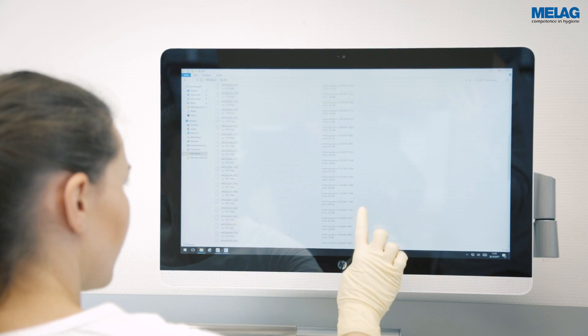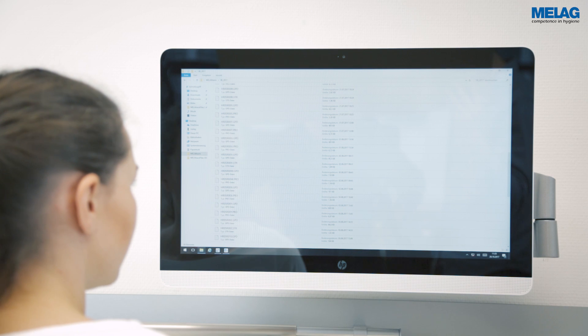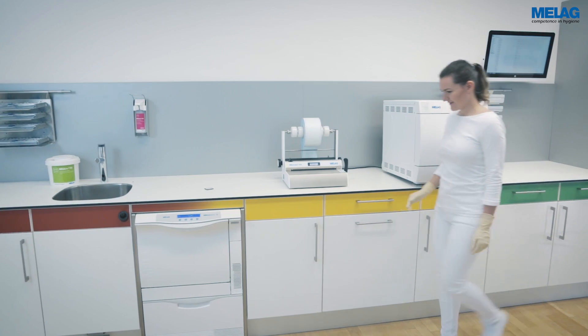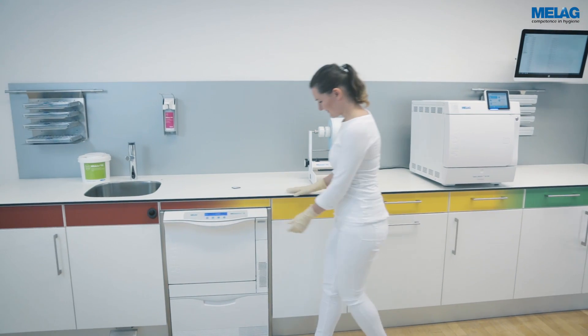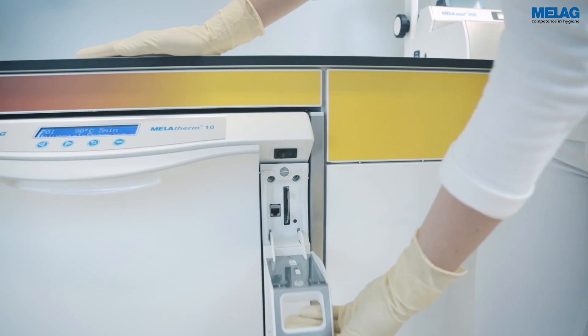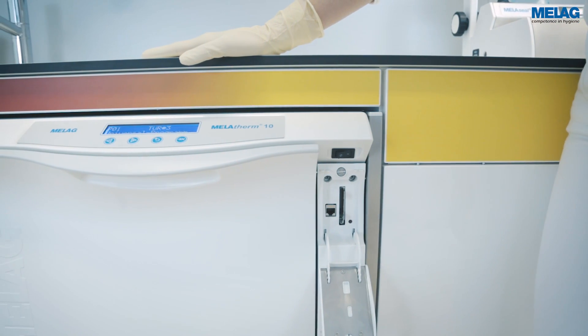The Miele Flash CF card, which is included in the scope of delivery, is preset as an output medium. The slot is located behind the cover cap on the right-hand side of the Miele Therm 10.